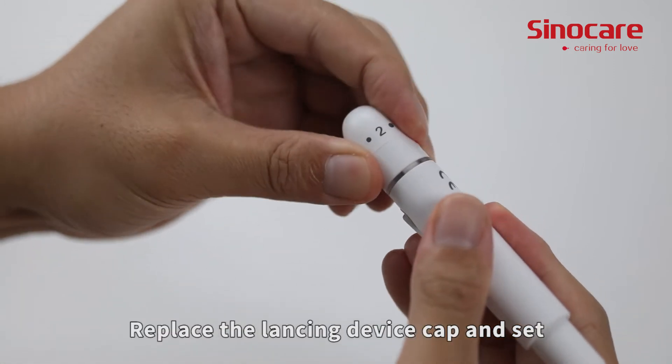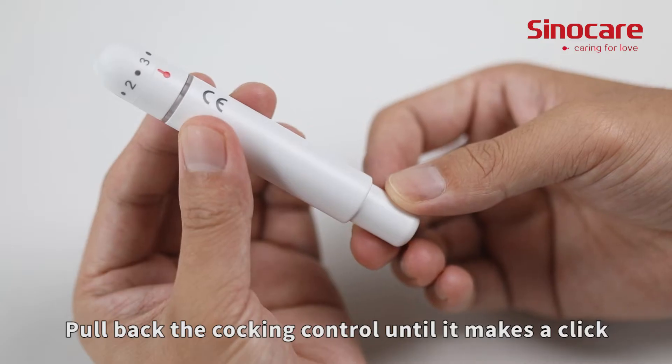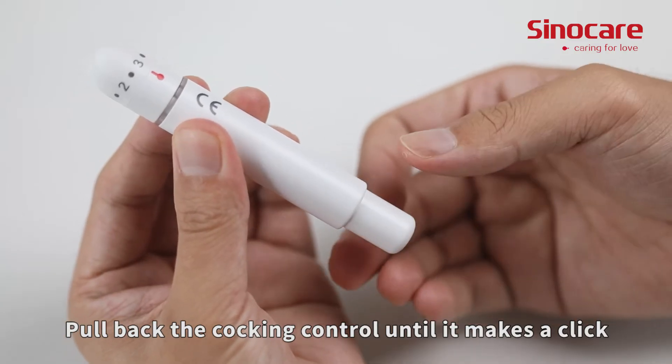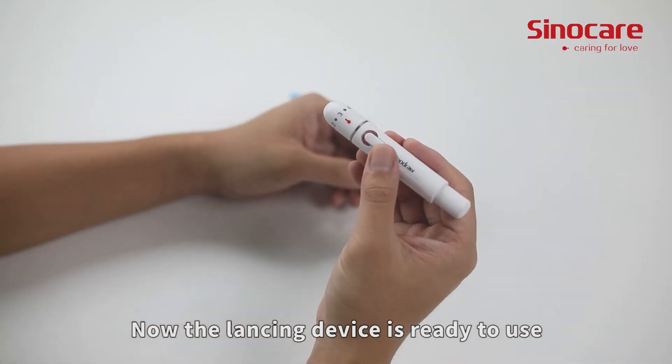Twist off the protective cap until it separates from the lancet. Replace the lancing device cap and set the puncture depth to the desired number. Pull back the cocking control until it makes a click, then release. Now the lancing device is ready to use.